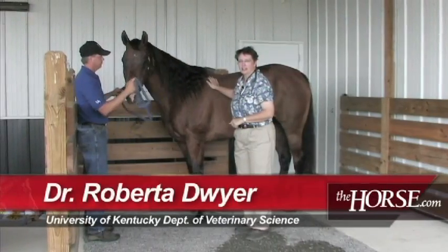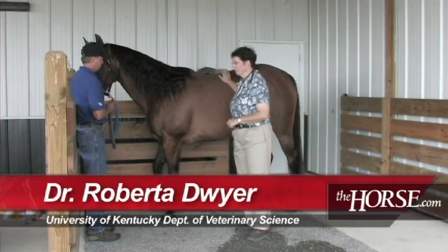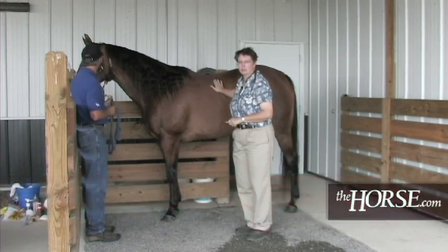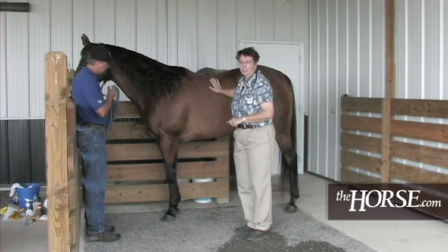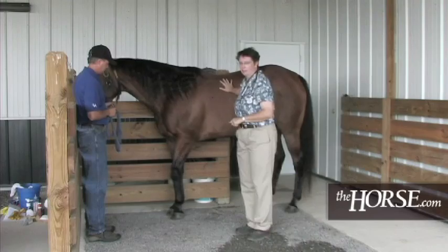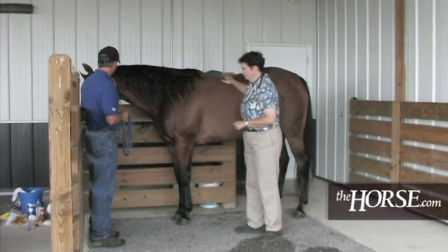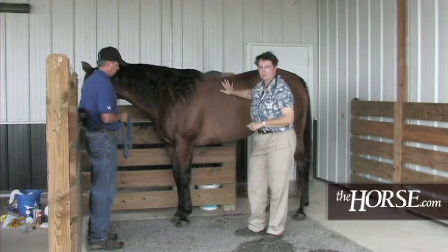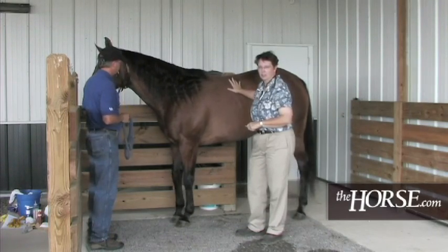I'm Roberta Dwyer, a veterinarian at the Gluck Equine Research Center at the University of Kentucky. Today we're going to talk about taking some vital signs on your horse. This is critical for every horse owner to know how to do on every animal on their farm. We have a willing volunteer here and we're going to start out with TPR: Temperature, Pulse, and Respiration.